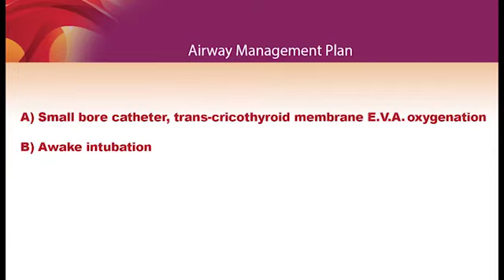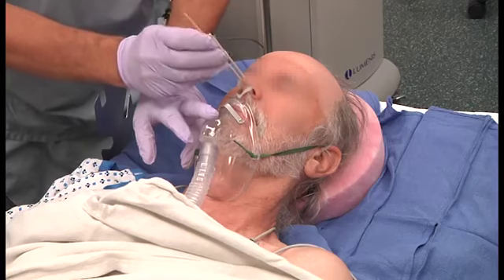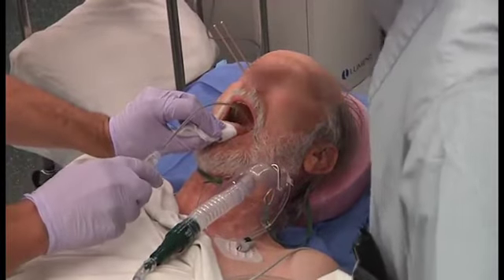15 minutes prior to coming to the operating room, the patient received 0.2 milligrams intravenous glycopyrrolate and nasal spray with oxymetazoline. In the operating room, local anesthetic was applied to the nasal cavity and nasopharynx and to the oral cavity and oropharynx.